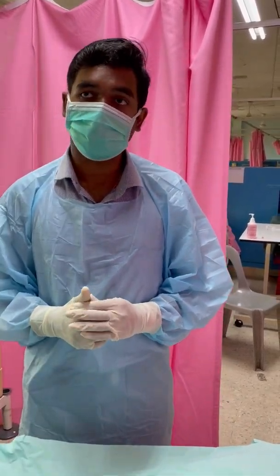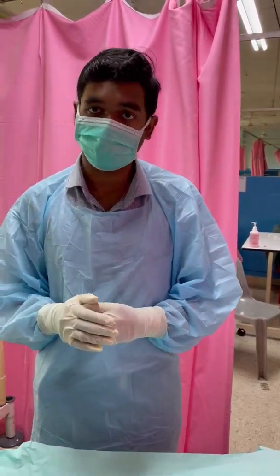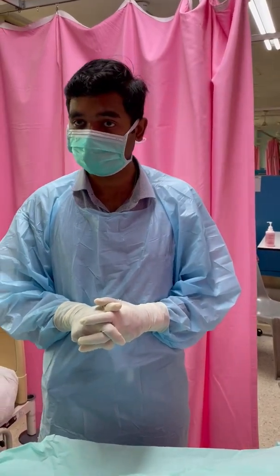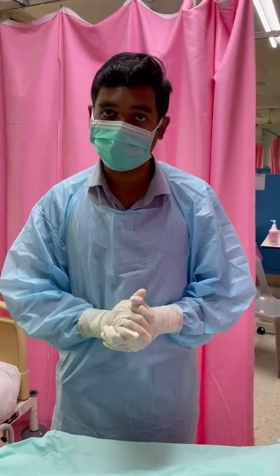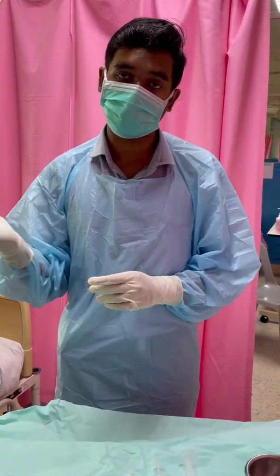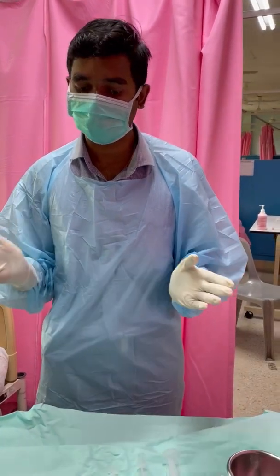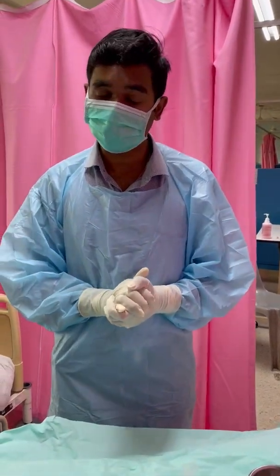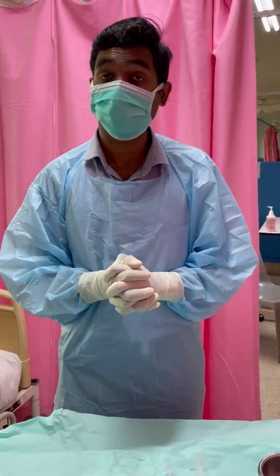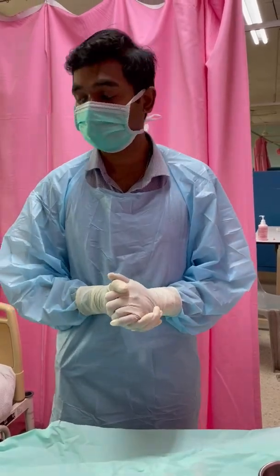Initially we drained the fluids under needle thoracocentesis under a controlled environment. Then we proceeded with a right pleural pigtail insertion for this patient. After 3 days, once the drain output became less than 200, we planned to proceed with the talc pleurodesis. The procedure was explained to the patient, and options of sclerosing agents, bleomycin and talc, were given. Patient was keen for talc.